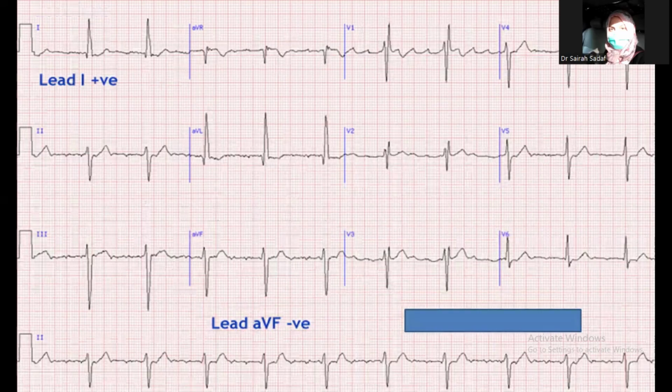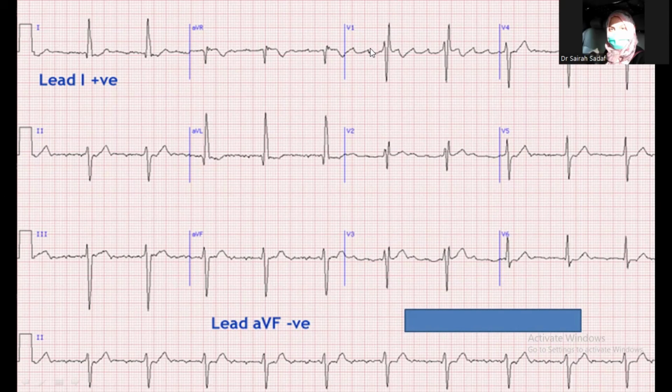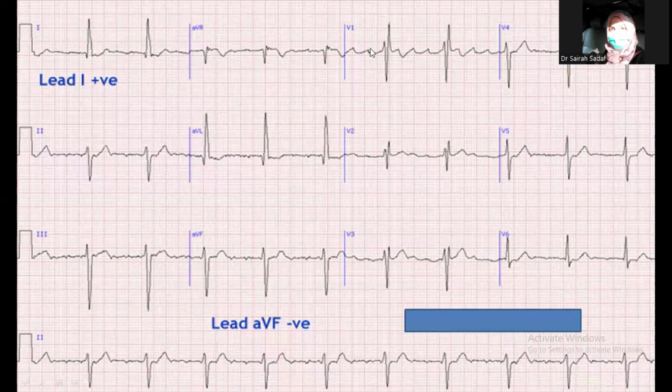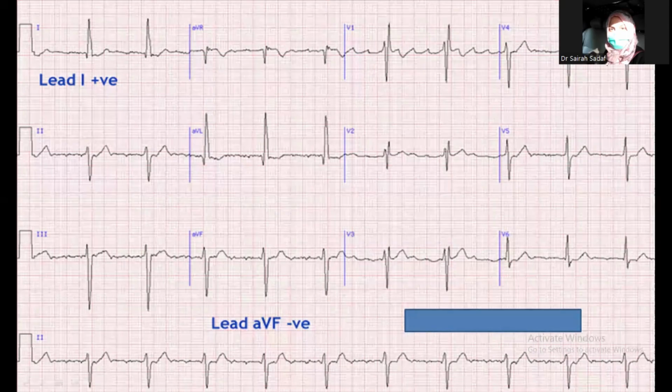Next slide. Now about this slide. Let's see what they are saying. Tell me, is this pathological or non-pathological? My PGRs are right, and let me see. Show me that you understood it as well. Yes, pathological. Very good. Excellent. Great. This is a pathological left axis deviation.